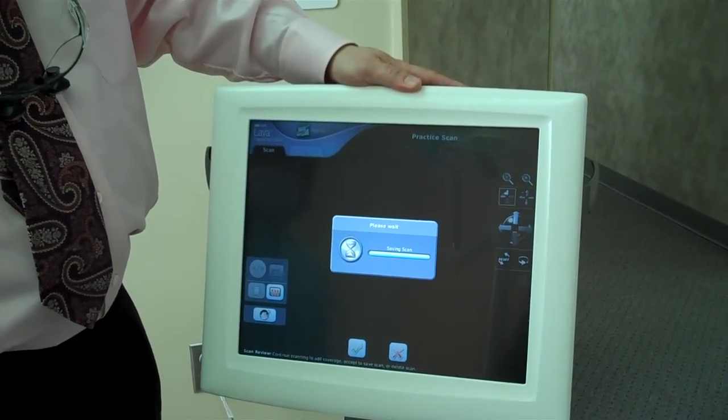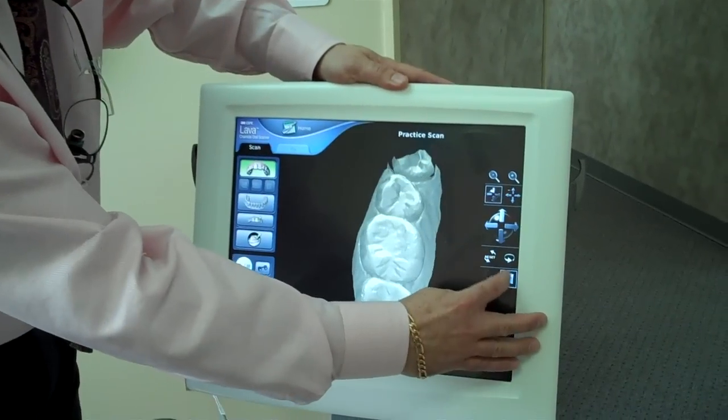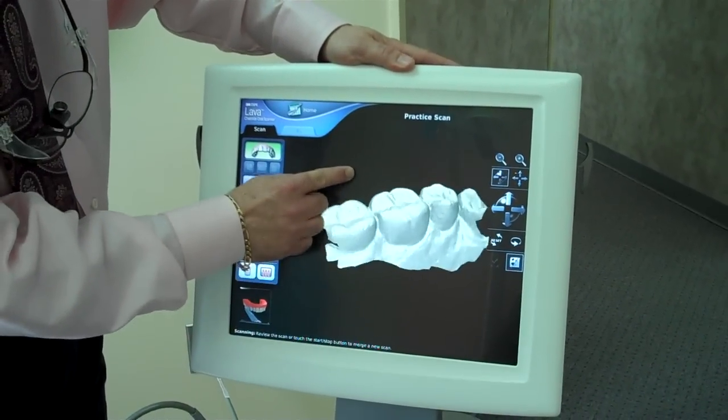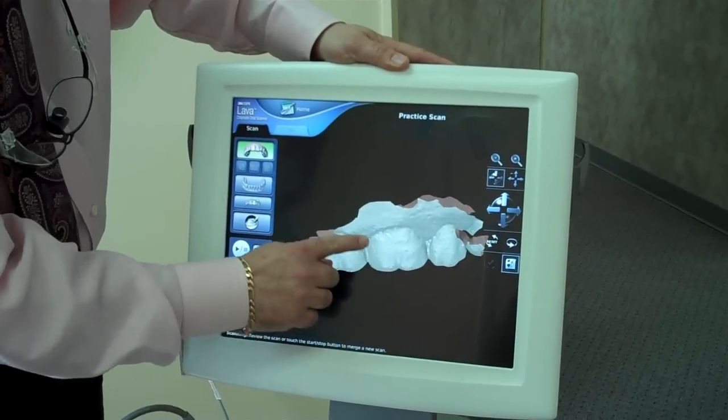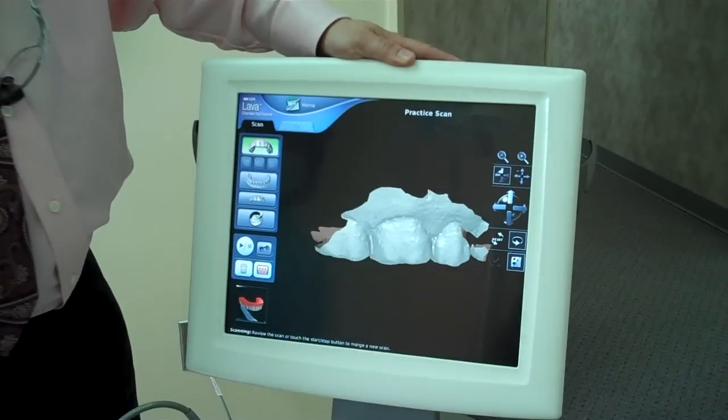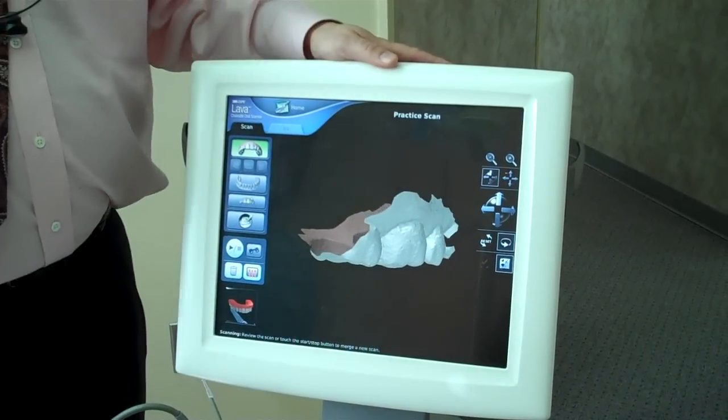And you can see the 3D image of the patient's teeth. So what we have here is a picture of three molars — these are upper molars. So I'm going to turn it upside down here like that.